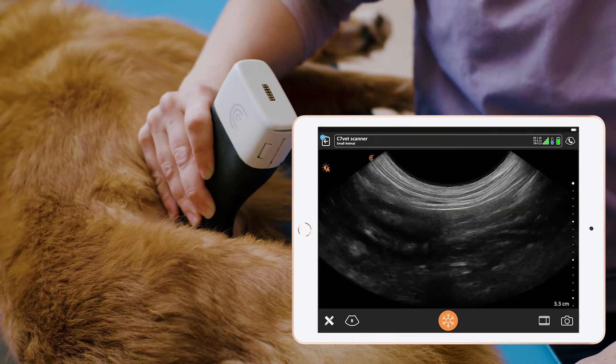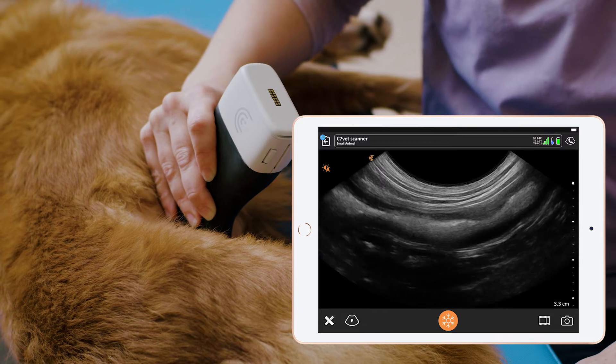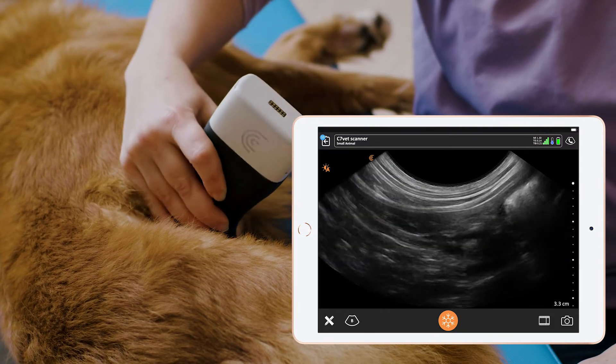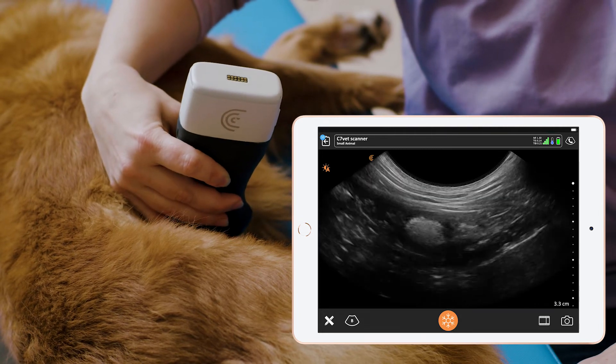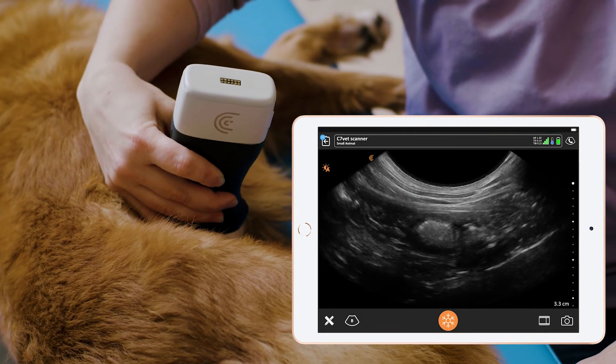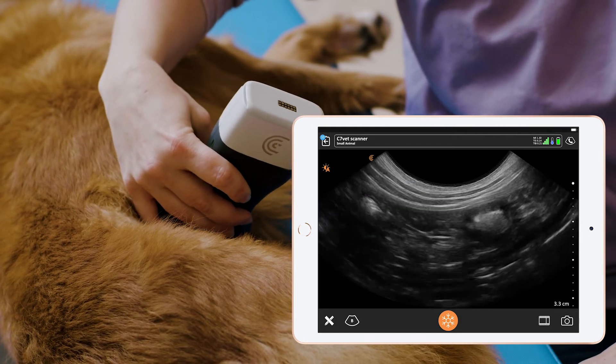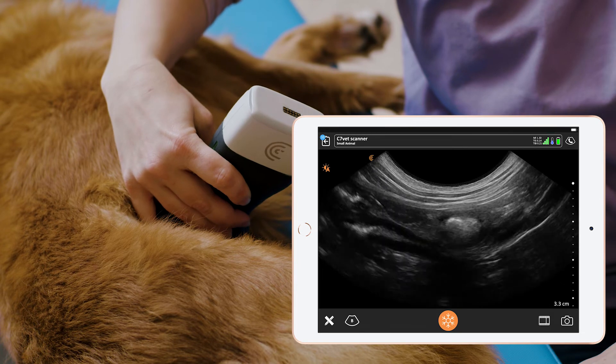To get a good view of the pancreas, it can sometimes be advantageous to get a transverse view. If we rotate the probe 90 degrees we should get this triangular structure on the side of the duodenum, which is the pancreas.